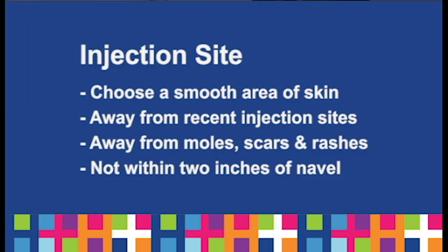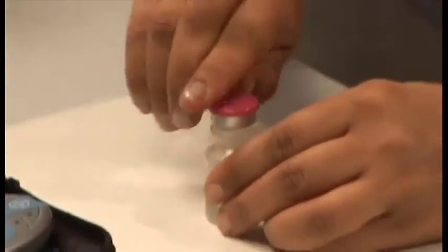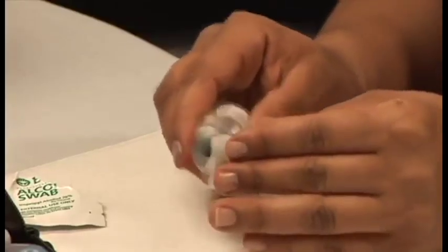Clean the injection site with an alcohol wipe. Open a new bottle of insulin, take off the cap, and leave the rubber stopper in place. Wipe the top of the bottle with a clean alcohol swab.